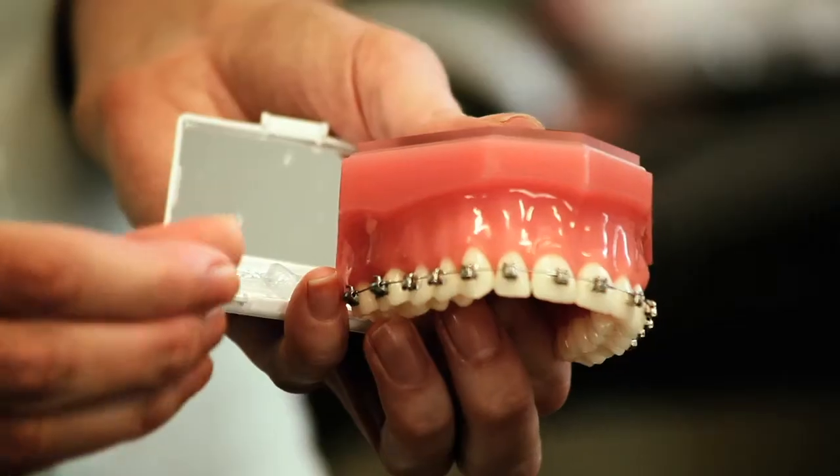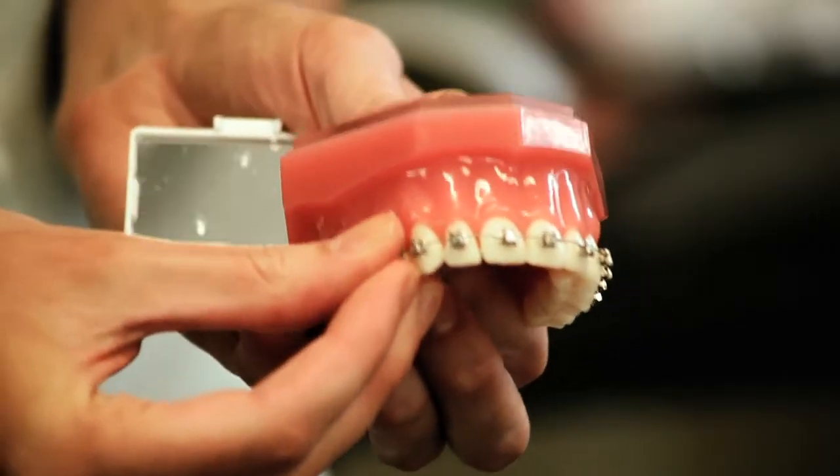While your cheeks get used to the brace, you may need to use some wax to cover any areas that rub. This acts like a cushion. Simply dry the brace in the sore area and place a ball of wax over the bracket that's rubbing.